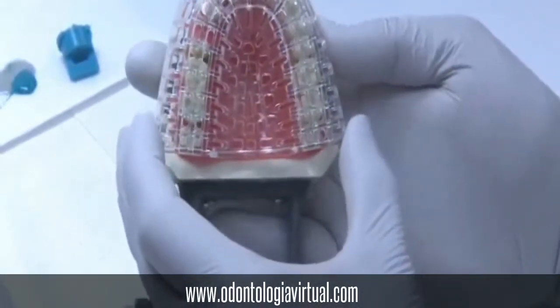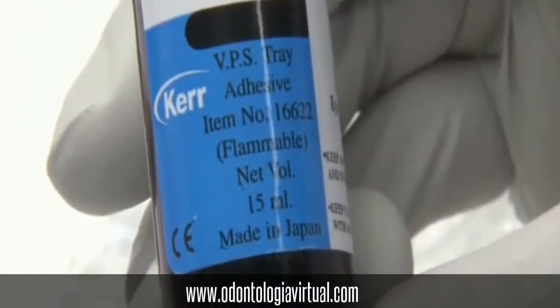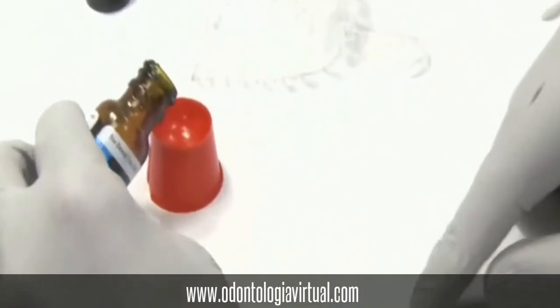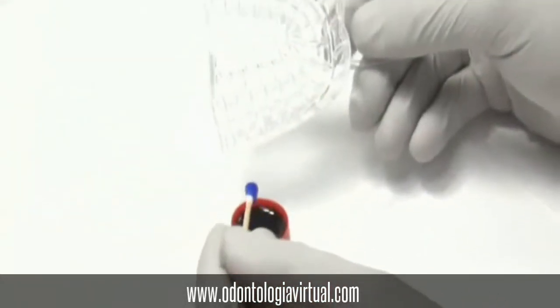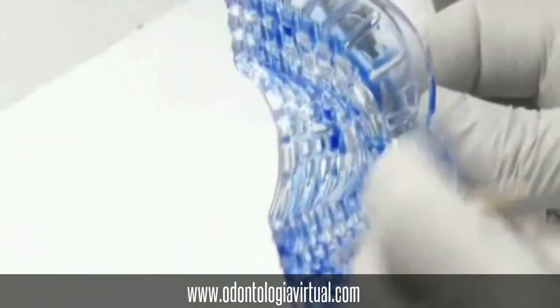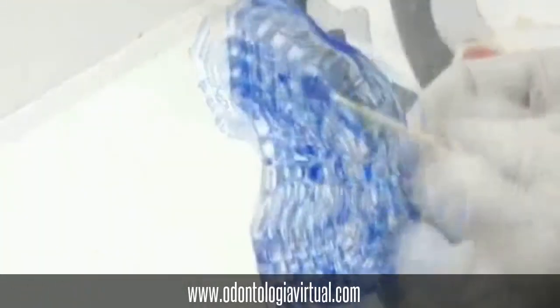We will practice the seating of that impression tray and then we will start to apply the VPS tray adhesive. Pour some of that tray adhesive into a dappen dish. Use a cotton tip applicator and apply that to all surface areas of the impression tray. Once you have done that, you have to wait approximately five minutes until the VPS tray adhesive is dry.